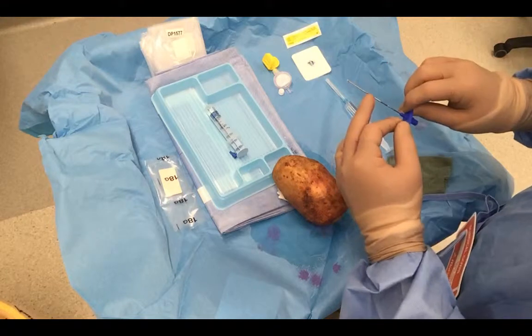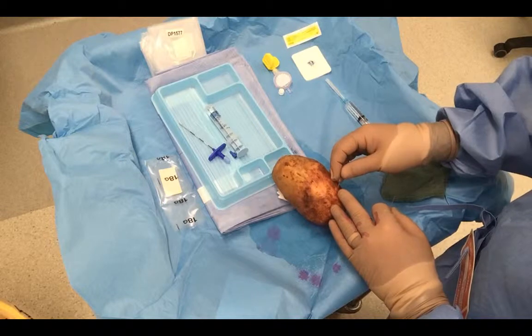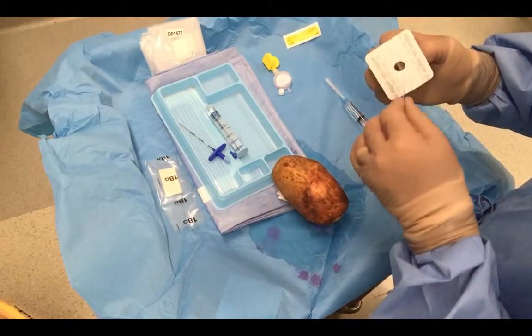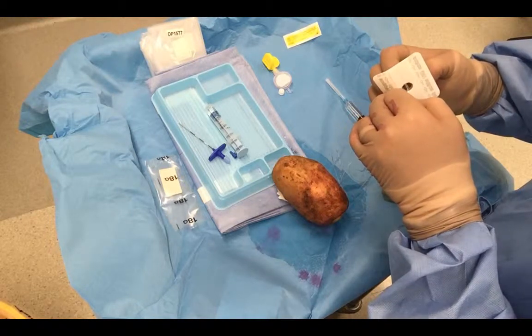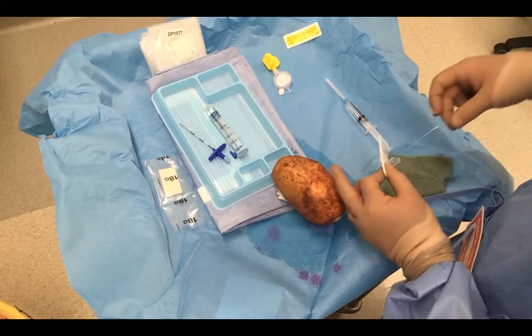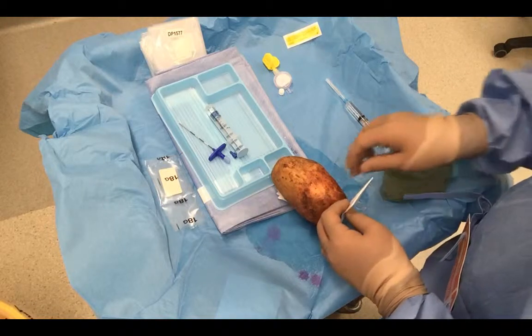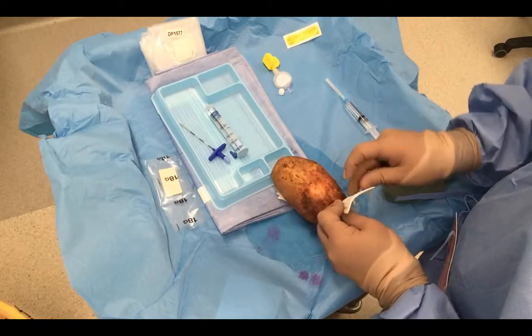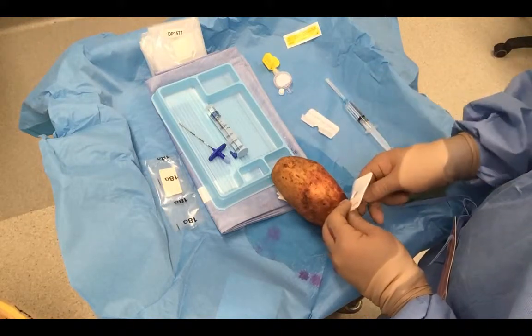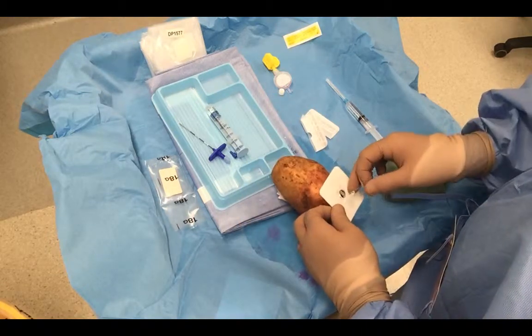Now, I had a loss of resistance to saline at 3 centimetres on this patient, and my catheter is currently sitting at 9 centimetres up the skin. What I'm going to do is fix my epidural lock by threading my catheter through the device, cautiously advancing that without removing the catheter from the patient, and I'm going to affix it to the patient's skin. I hope. Although I must say this is the first time I've used the catheter lock on a vegetable patient.